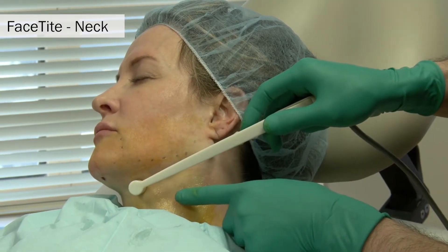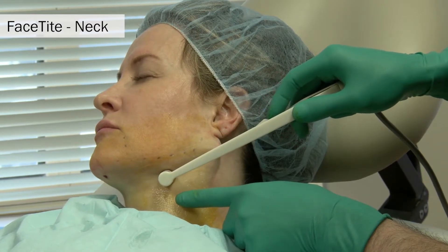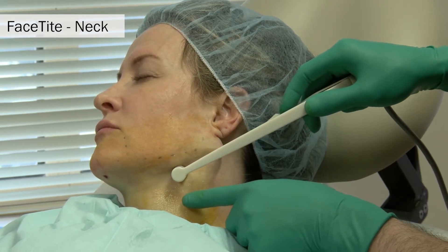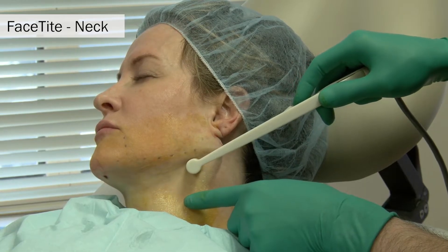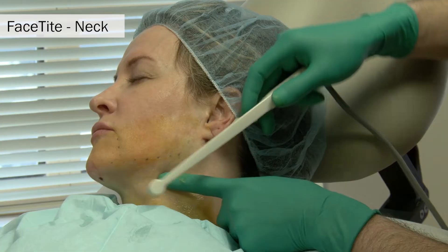Next, ultrasound gel is applied to the neck. The probe is advanced and slowly withdrawn. The energy travels from the deep probe to the more superficial probe that rides on top of the surface of the skin.